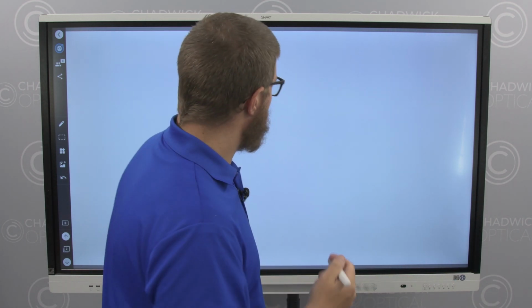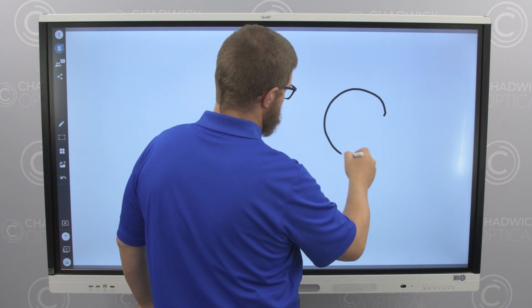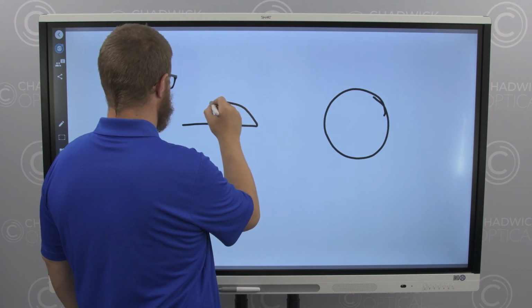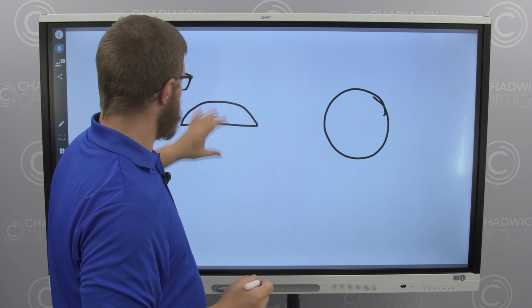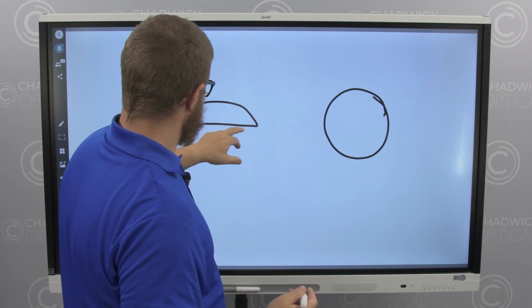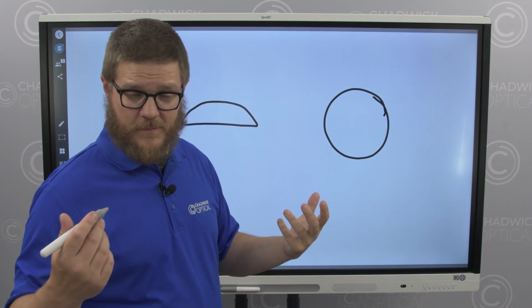The answer is going to be a little bit different, whether it's a high plus prescription or a high minus prescription. Today we're going to talk about high plus. So your ideal shape for a frame is going to be round. The reason being is that when we make a high plus lens, that lens is a very steep curve, and anything that we can do to keep it thin on the edge, that goes all the way around a circle. So if we can keep that thin edge matched up to the rim of the frame, you can have a very aesthetic pair of glasses.